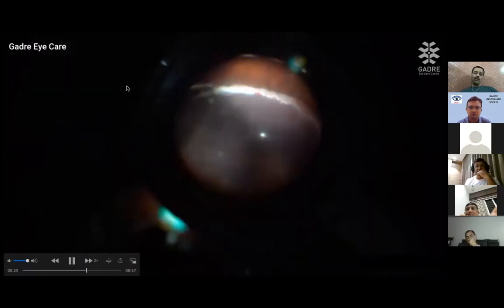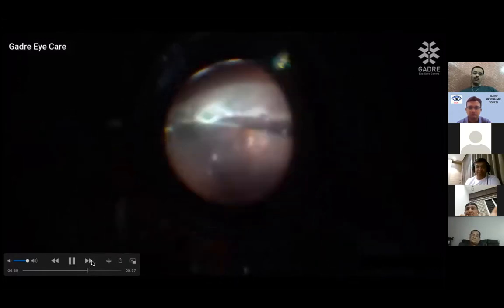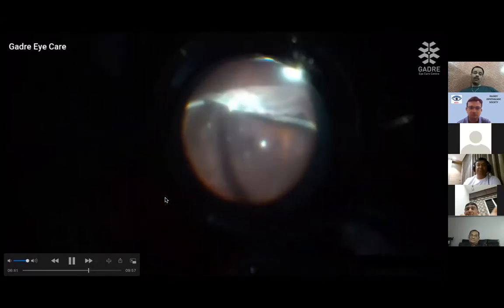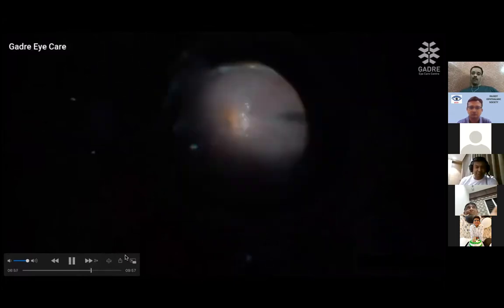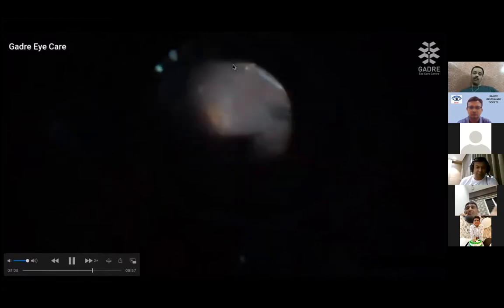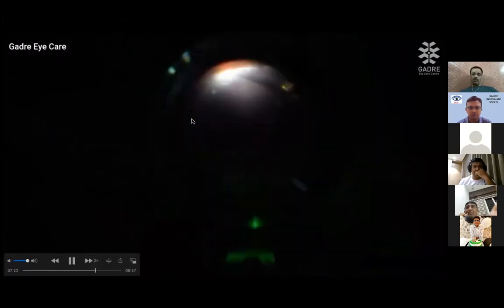One has to take care not to injure the choroid in this phase. So being a little generous with the relaxing retinotomy here, I removed the PFCL, lifted up the inferior retina, and then proceeded with the inferior retinectomy. On completion of this minimal inferior retinectomy, PFCL was injected again, and one notices the settling of the lifted part inferiorly. Most of the surgery was now over.